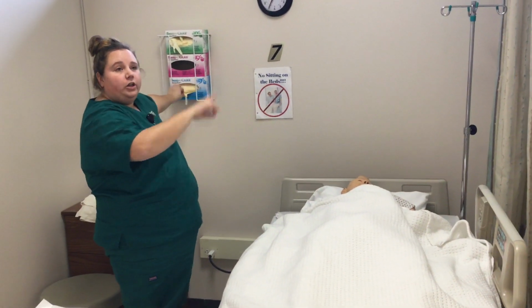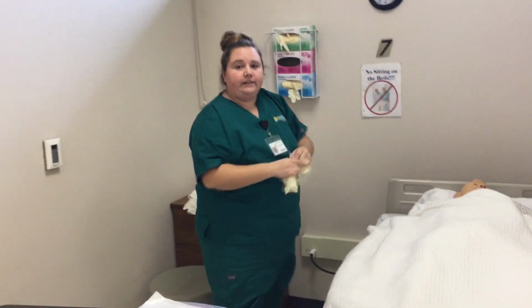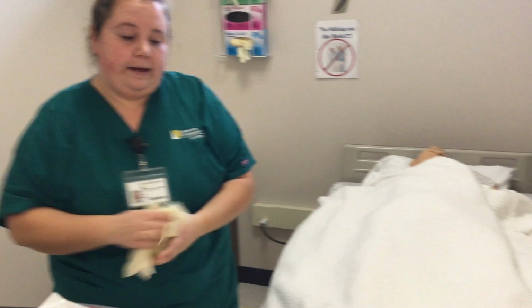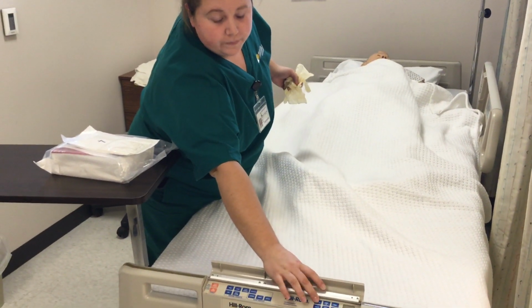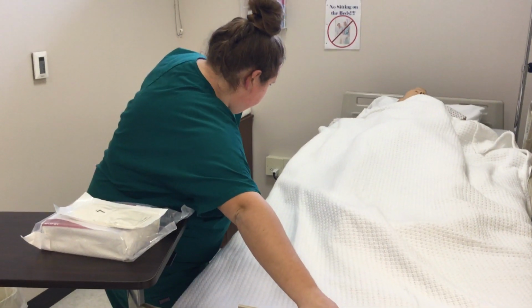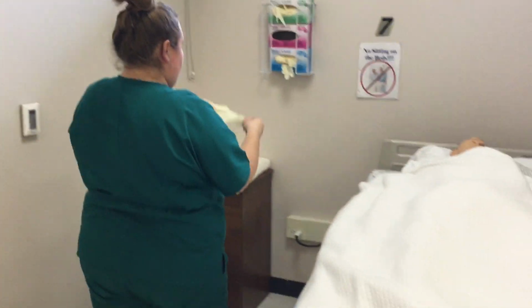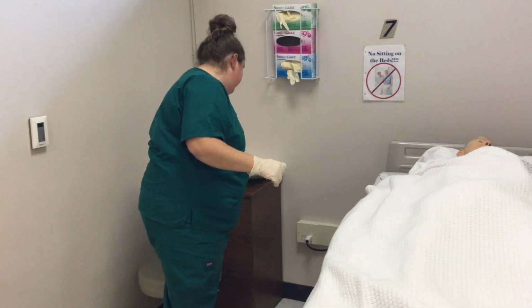I'm going to make sure that I provide privacy, that the bed is at a working level, that the side rail opposite of me is up, and the side rail on the side where I'm standing is down. Now I'm going to drape the patient. And of course, I already said it, but perform hand hygiene before I put gloves on.